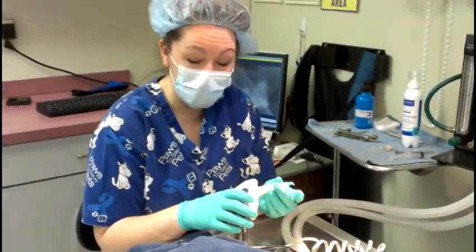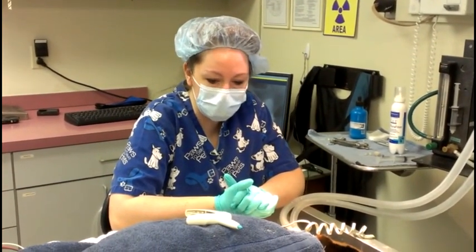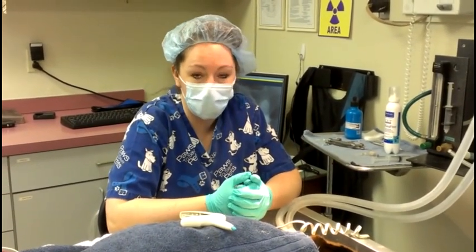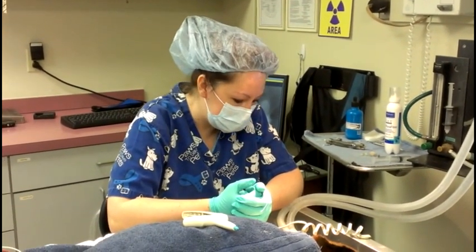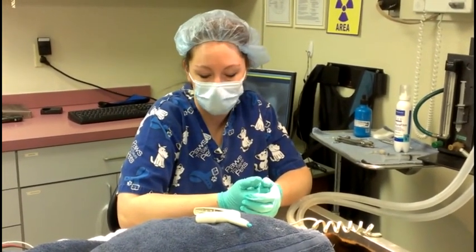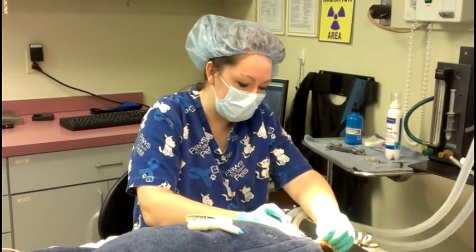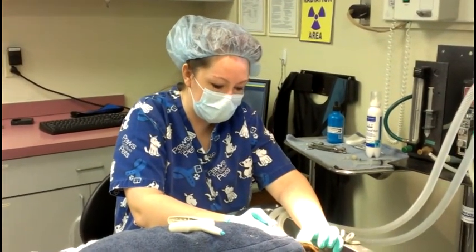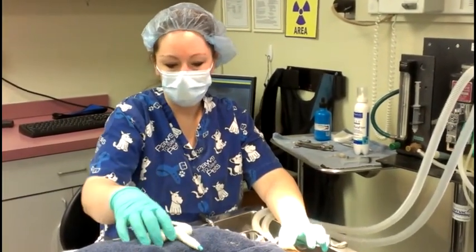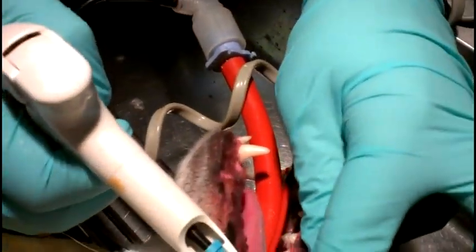We have a product here called Orivet, which is a sealant for the teeth. We seal them here after every dental procedure, and then the ideal situation is to continue that product at home. It's applied between the teeth and the gum line, and that's going to keep future plaque and tartar from being able to stick there and build up the kind of calculus that she had on there today. So you want to apply it to a dry tooth. As I go, I'm just going to dry the teeth off a little bit so it sticks better. And then we're just going to apply this wax right at the gum line.